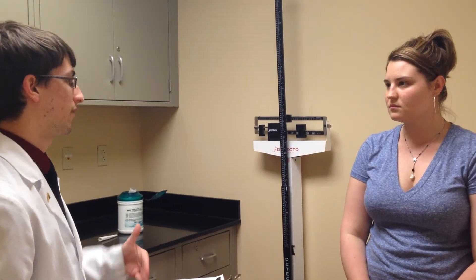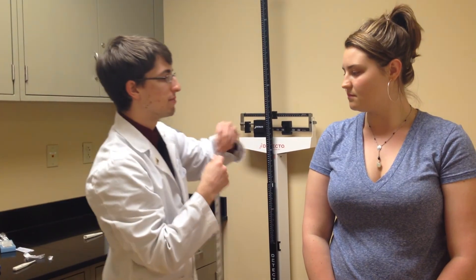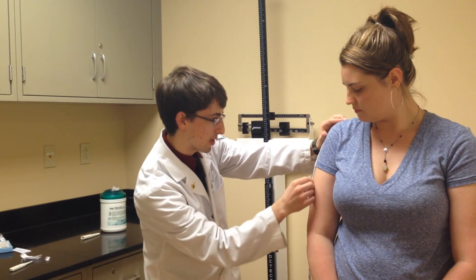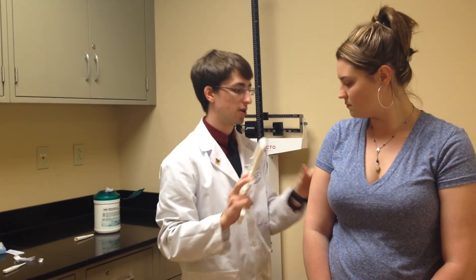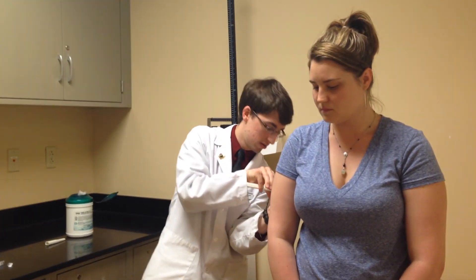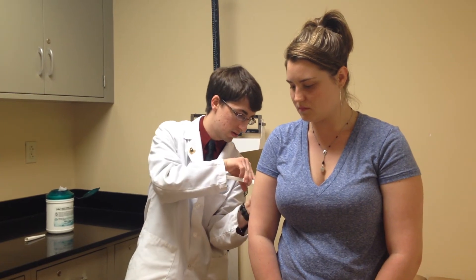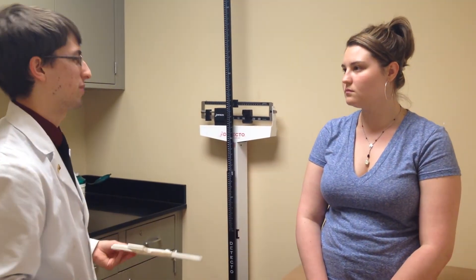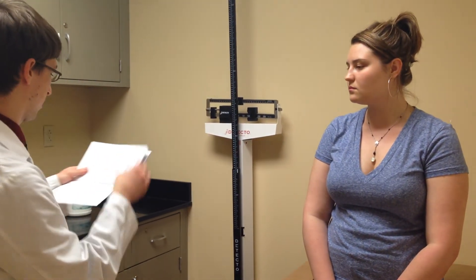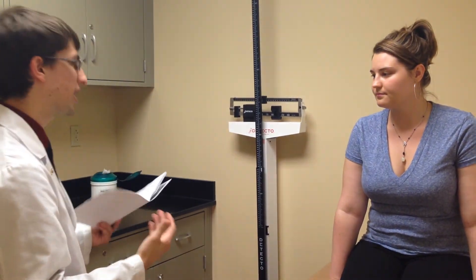Next, I'm going to do what's called a skinfold thickness test, which will tell me what percentage of your body is fat. I need you to continue standing. I'm going to find the midpoint between your shoulder blade and your elbow — that measures about 15 inches, so 7.5 inches is my midpoint. I'll do this test three times to average out the best results. I got measurements of about 30, 29, and 28, which averages to about 29 millimeters. Looking at the chart, for a woman with a 29-millimeter skinfold thickness, you're at about 36% body fat.